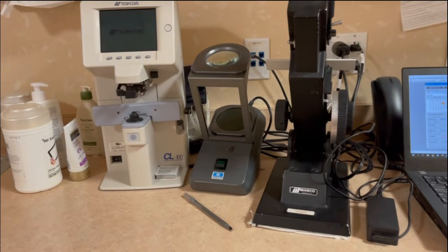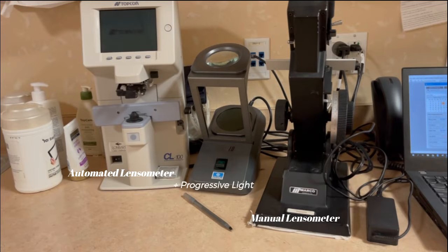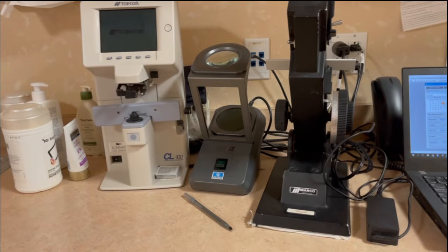First things first, here are our lensometers — we have a manual one as well as an automated one. On the left in the middle there is the light we use to read the plus power prescription. Basically it reads the lenses on your glasses and helps us get a basis for what we'll plug into the phoropter. If we have to read your glasses, you also saw that in the beginning video — I had my glasses inside the manual lensometer. So that's what that is.